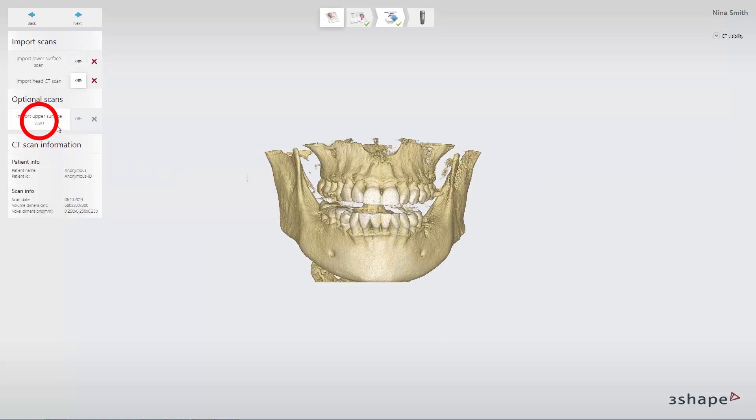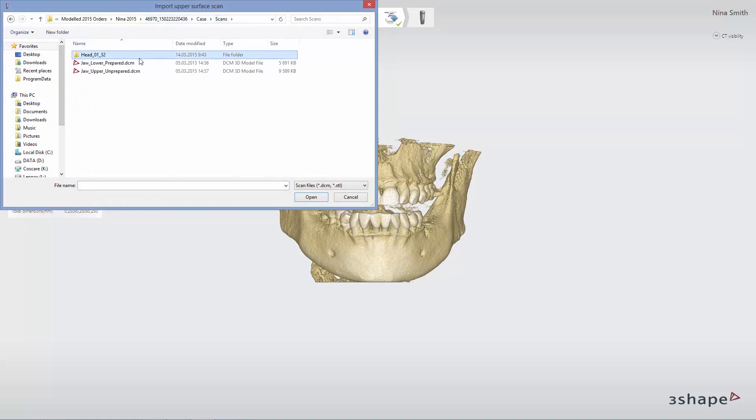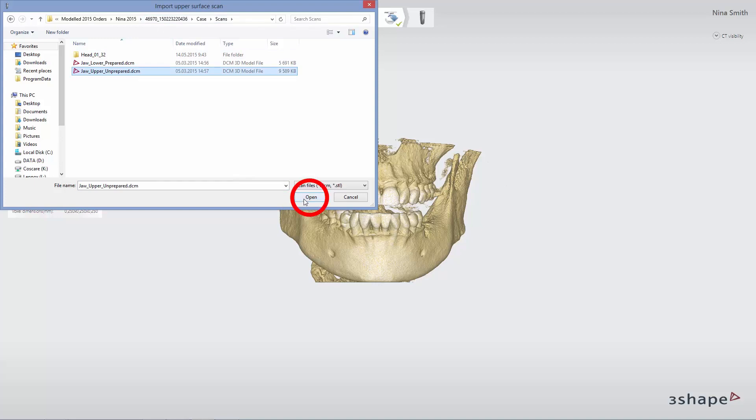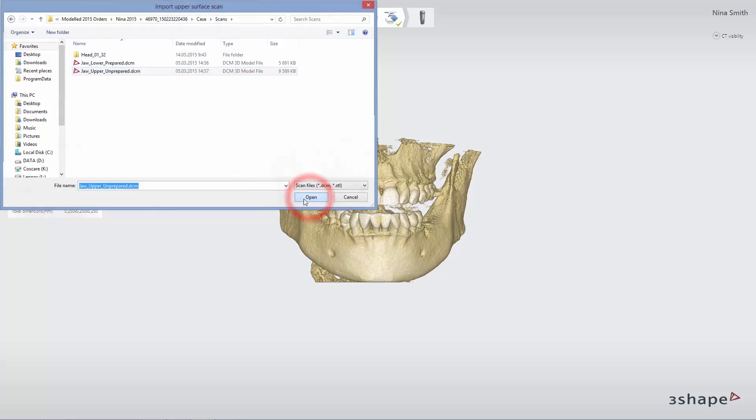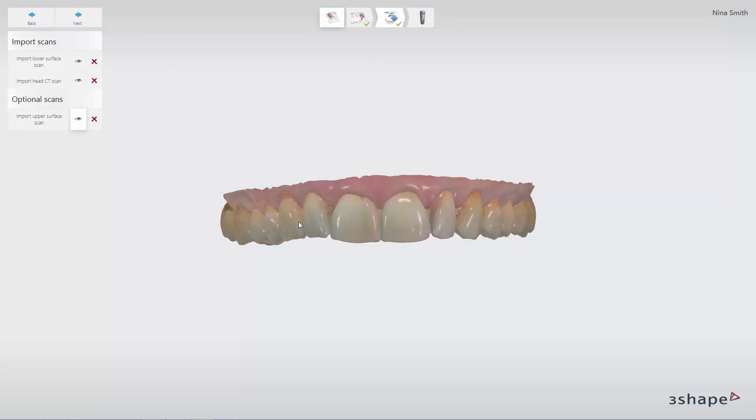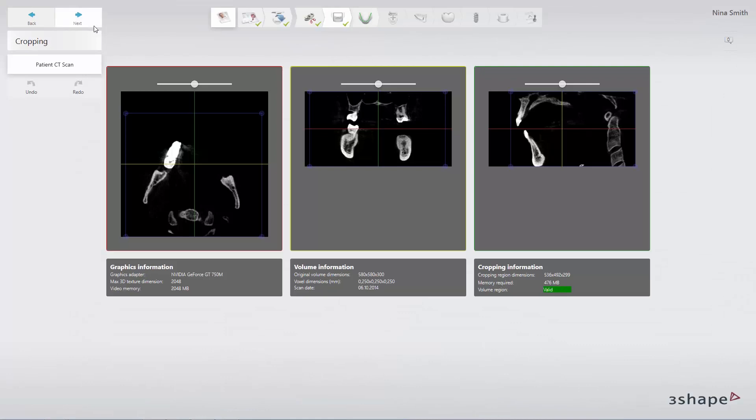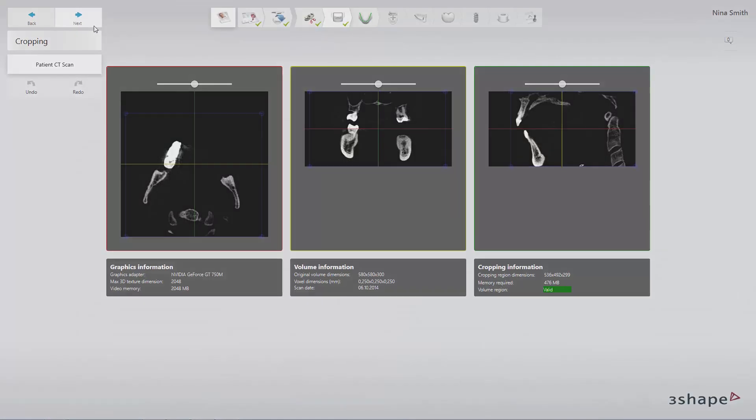Import an antagonist surface scan if needed. When all relevant scans are imported, click Next to proceed to the main workflow. You have now created a tooth supported case.